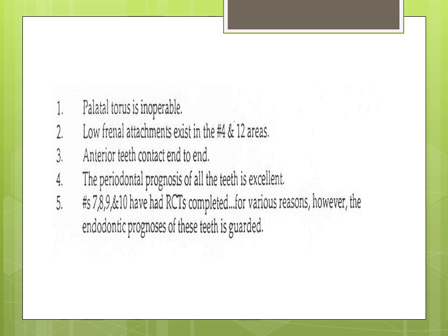We will examine the articulated casts for areas of habitual occlusal contact. Subsequently we will plan tooth preparations for guiding planes, axial recontouring, and rest seat preparation. We will perform these preparations on a duplicate diagnostic cast to verify the efficacy of our proposed tooth modifications. Any existing partial dentures will be examined and the patient's subjective opinion will be considered in our plan.